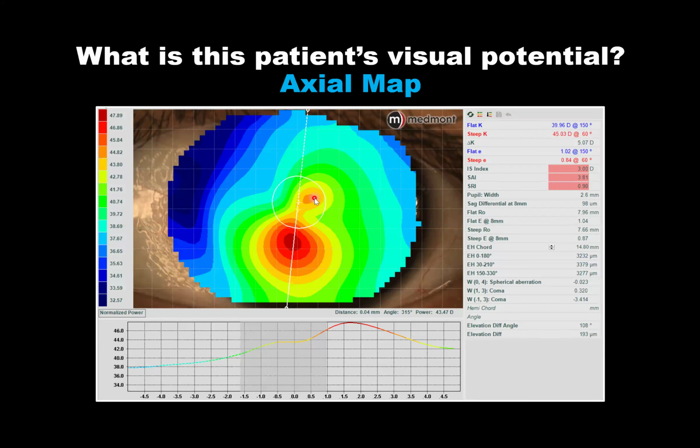Un análisis muy sencillo es cuando tenemos el topógrafo a la mano, esa línea, en la línea del eje que ustedes ven ahí, se puede rotar de un lado a otro. Y según se rota, usted puede ver la parte inferior donde está un poco más gris, y eso nos va a decir el cambio en dioptría a través de la pupila. Esa área gris que está inferior corresponde a la pupila. Sabemos que si el cambio dióptrico a nivel de, por ejemplo, 5 milímetros es extremadamente alto, pues hay más irregularidad. Si son pocas las dioptrías, hay menos y por tanto mejor potencial de agudeza visual.